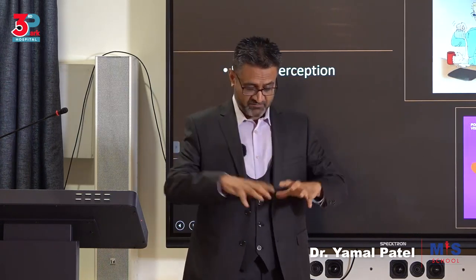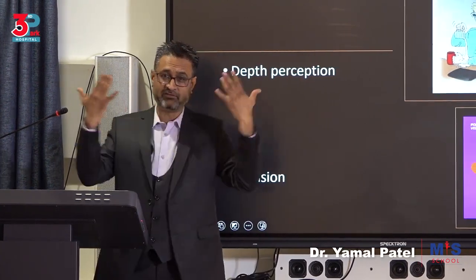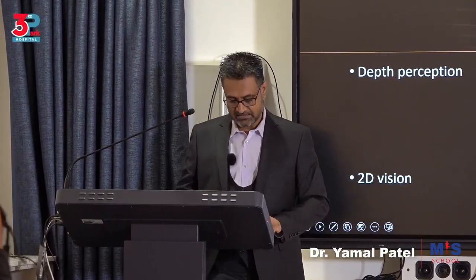So how to convert this 3D view that you are used to when you're doing open surgery into a 2D screen view where you can't see depth that clearly, where you don't know which structure is behind which in a proper way. It's all laid out on one screen. You'll have to practice and learn that.